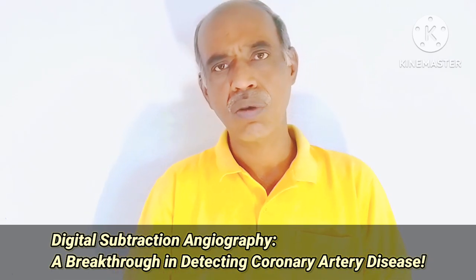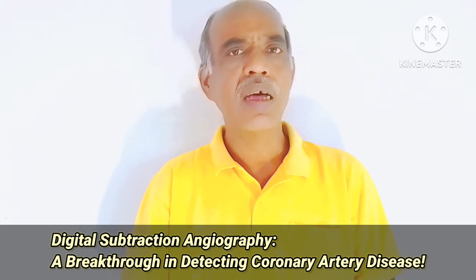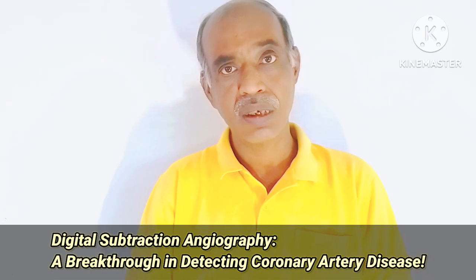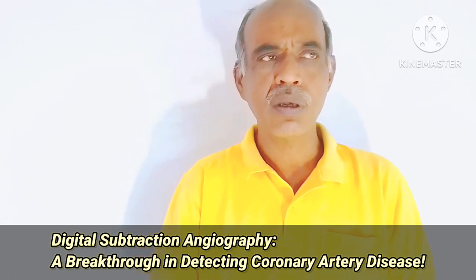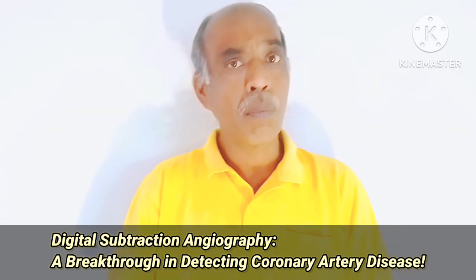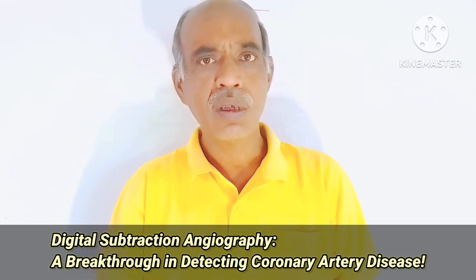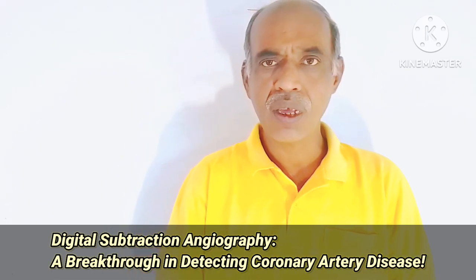And why is this called a breakthrough? Because it is able to detect even a minor stenosis. But limitations and risks are also involved, because multiple X-rays are taken. So there is an exposure to radiation.